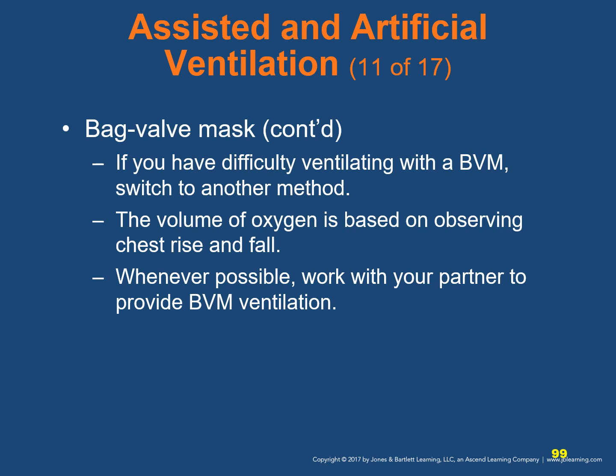Make sure the top is over the bridge of the nose and the bottom is in the groove between the lower lip and the chin. If the mask has a large round cuff around the ventilation port, center the port over the patient's mouth. Inflate the collar for a better fit and seal to the face if necessary.